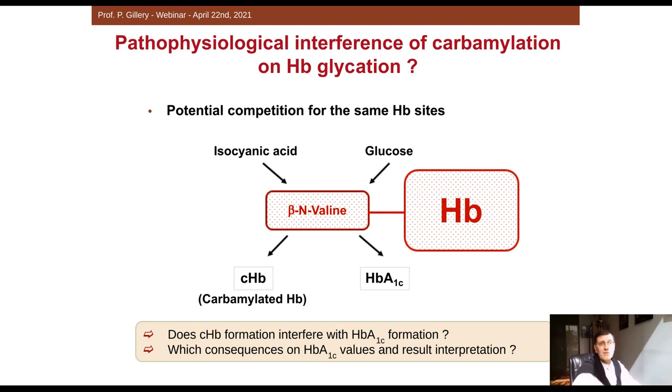So the question is: is there an interference of carbamylation on hemoglobin glycation? In fact, there is a potential competition for the same hemoglobin sites.